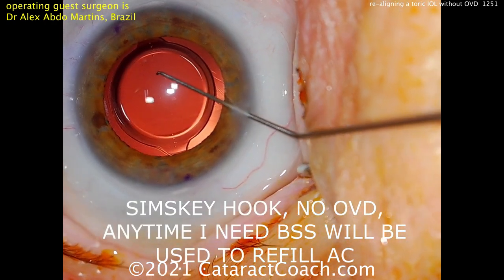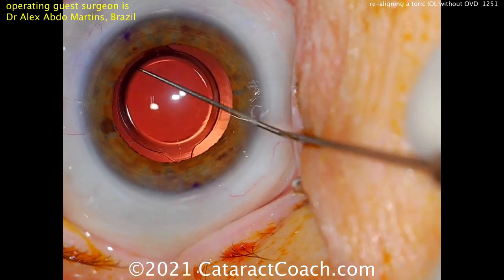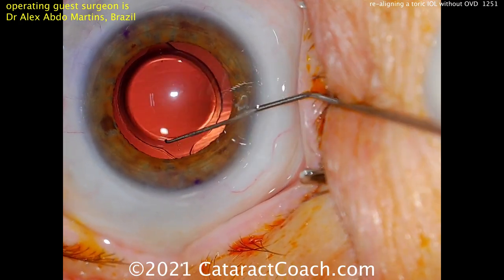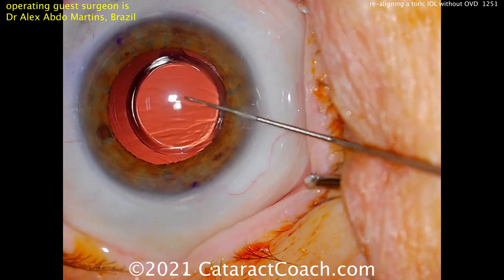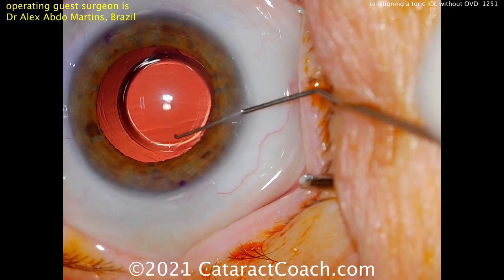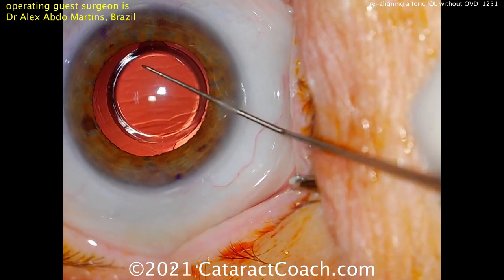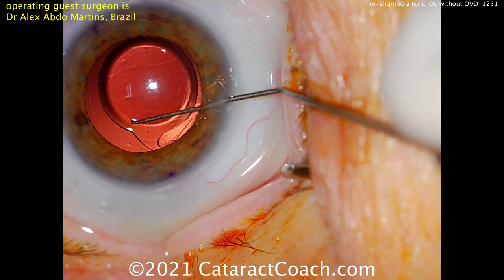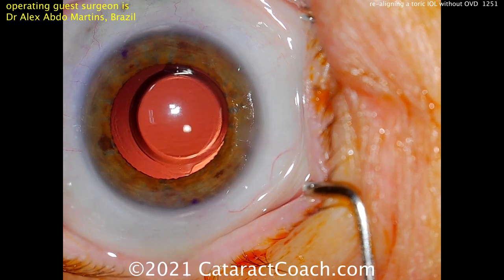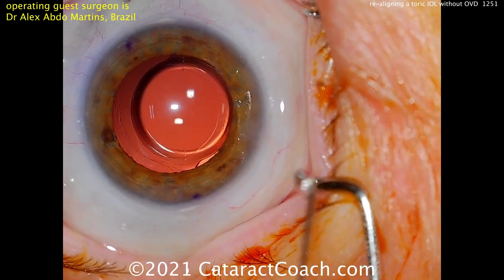To rotate the lens, you need to have the eye inflated. There are two options: since it's only 10 days out, the incision should open up pretty easily. What I would tend to do is use my IA probe to go inside the eye and inflate it. Or if you're using bimanual, you can use your infusion just to get BSS flowing. I agree you don't want to put viscoelastic in the eye — it's going to cause the lens to slip more and will need to be removed. Here you can see he's losing a little fluid, but you can refill the anterior chamber with balanced salt solution to reinflate.